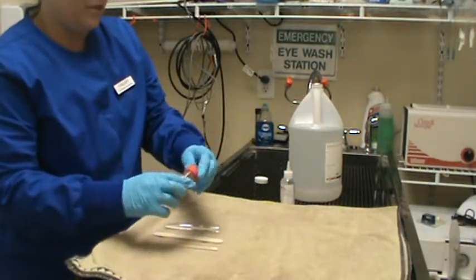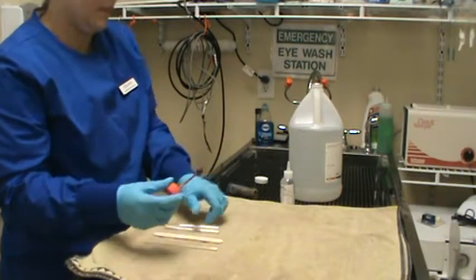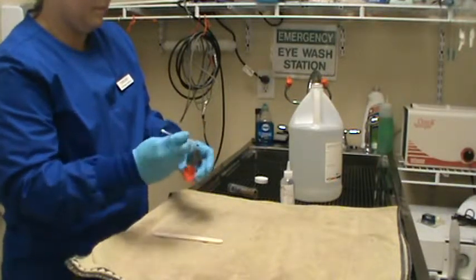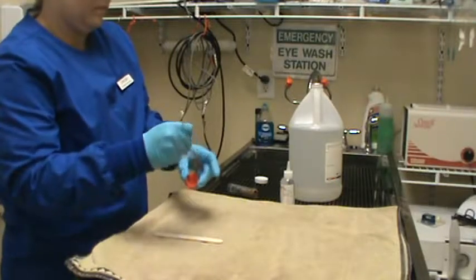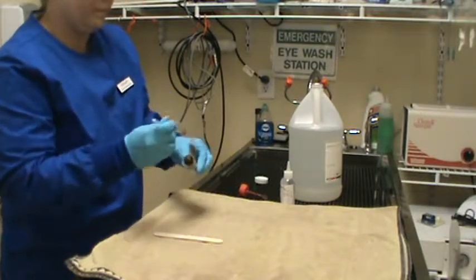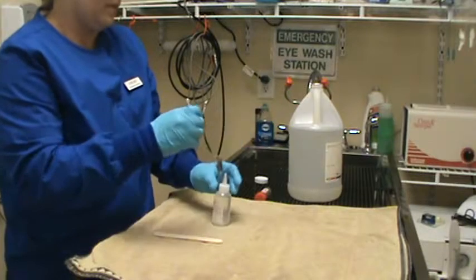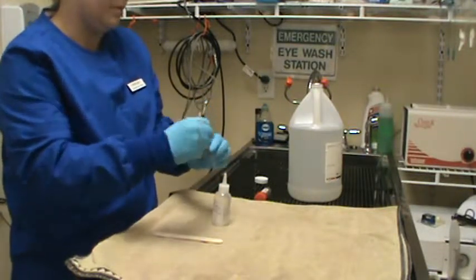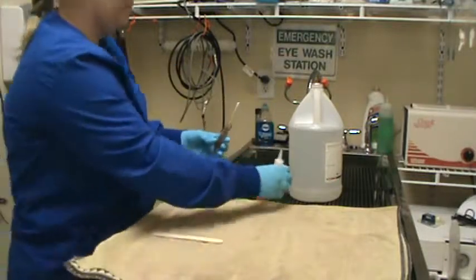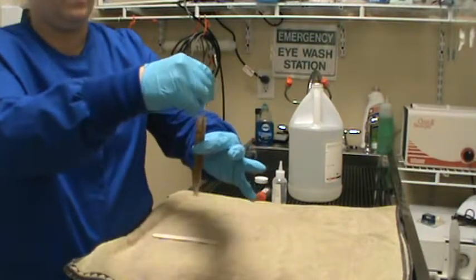I'm going to go ahead and introduce about a quarter teaspoon of feces into the container here. We're going to cap our sample and move the feces down to the bottom of the vial, then fill the vial about halfway up, and using our stick we're going to stir it into one homogeneous mixture.